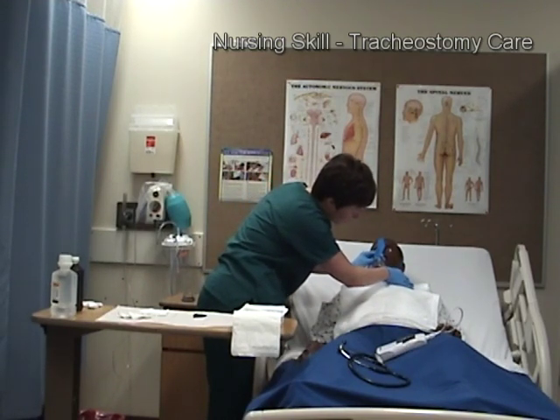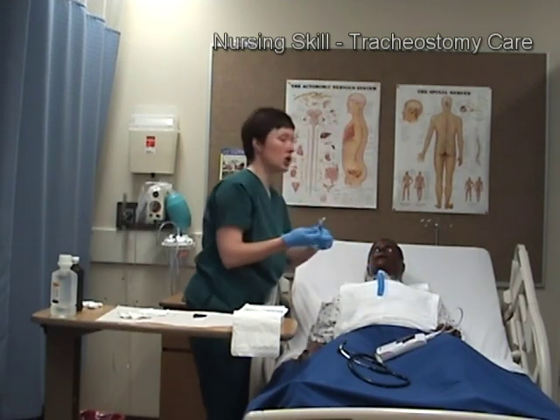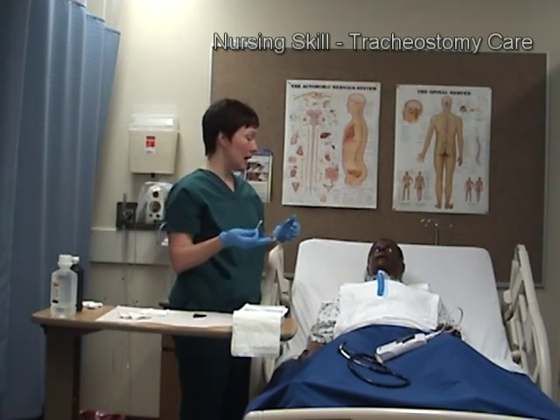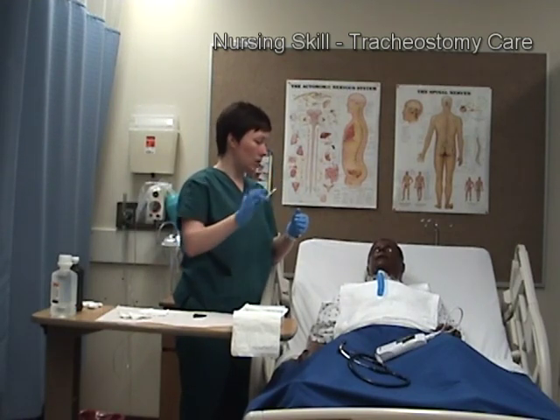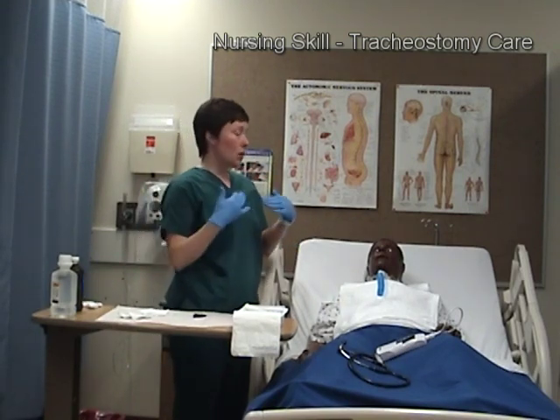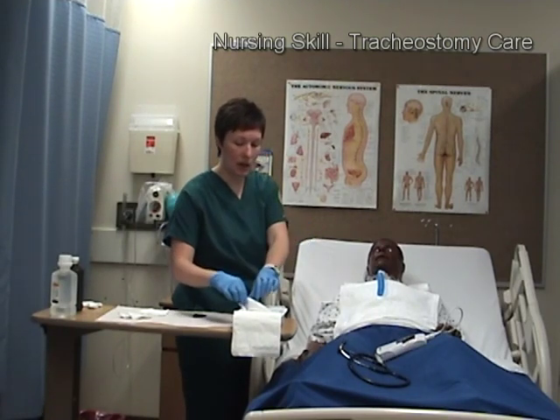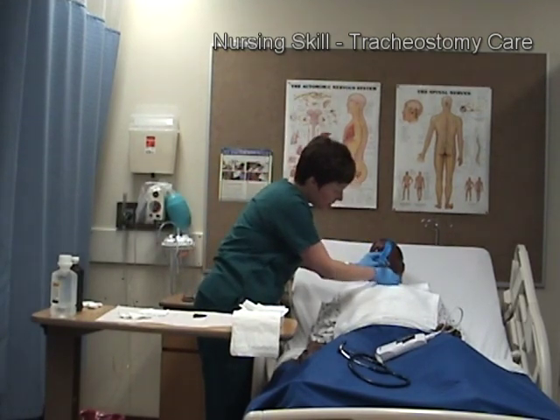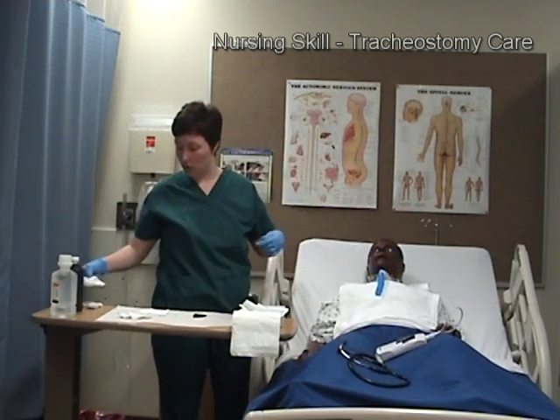I'm taking this opportunity not only to clean, but also to observe the condition of the stoma. I want to make sure there's no skin breakdown or signs of irritation or infection. I'll use a rolling motion with the cotton swab, not overusing it, and then toss it to avoid irritating the skin around the trach. Then I'll use cotton pads to clean around the area — just one pad each time, so I don't smear bacteria around.